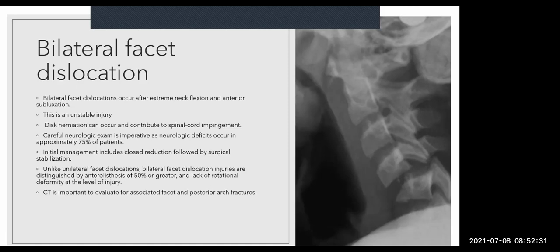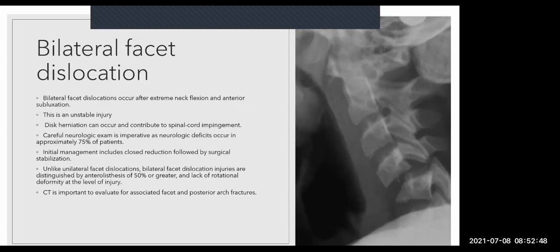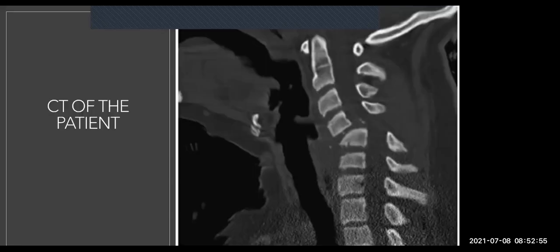But you understand now, you're going to tell him this is a bilateral facet dislocation. Patient has got evidence of neurological deficit. Which is the neurological deficit? I've excluded other injuries. Patient is going for a CT. You need to come in and see this patient. Okay. So you must remember, these are not injuries you're going to see every week. You get 1 or 2 of these a year. I'm talking about in total, all these severe injuries. But when they do come, they're bad, right?